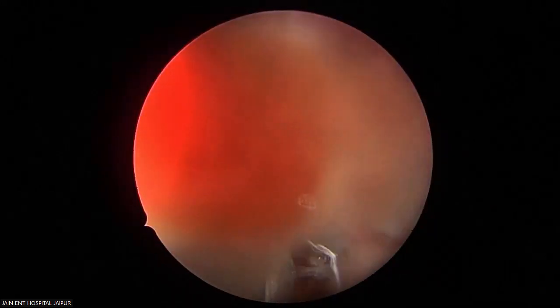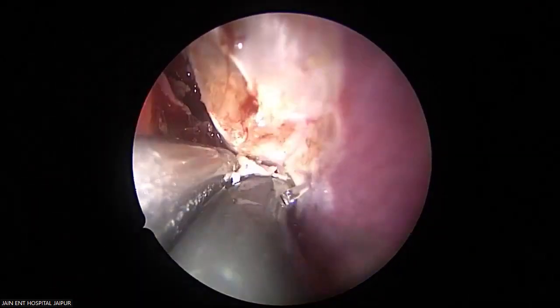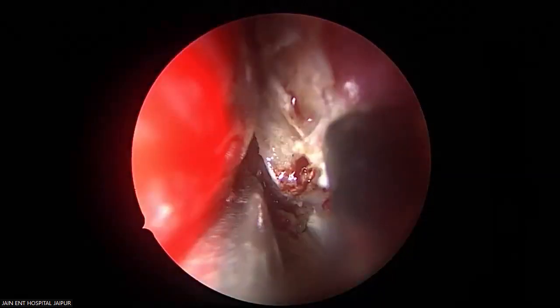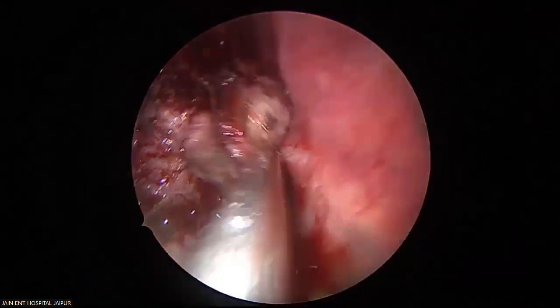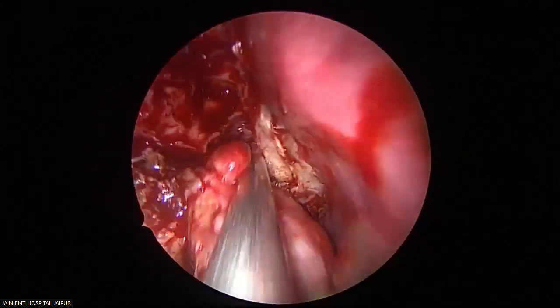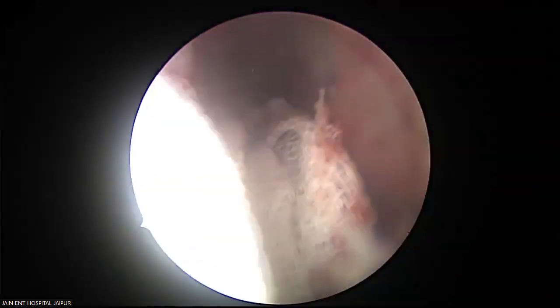See, very clear, completely separated from the septum. So quickly we have achieved the superior exposure. This is anterior exposure, this is anterolateral exposure, tumor surface being coagulated all the time. And this is your superior exposure. Clear?